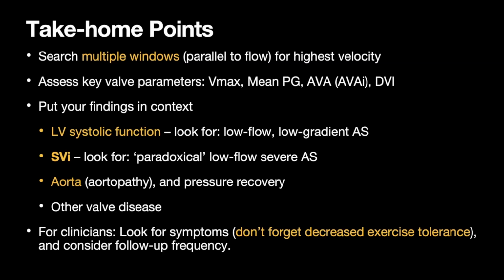And also thinking of things that can decrease your stroke volume coming out of your LVOT. So if you have severe MR, you may actually underestimate the stroke volume coming out of the LVOT. And of course, looking at the other valves, if you're referring to surgery, make sure that you're pointing out all the different valves that may need an intervention.